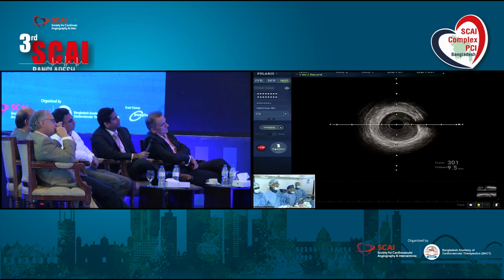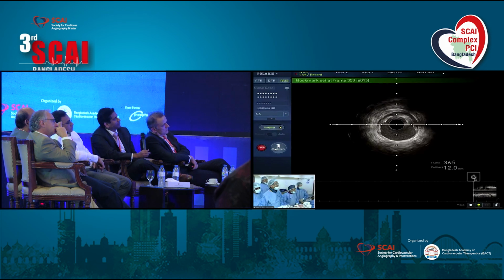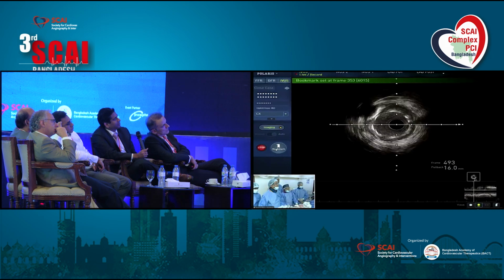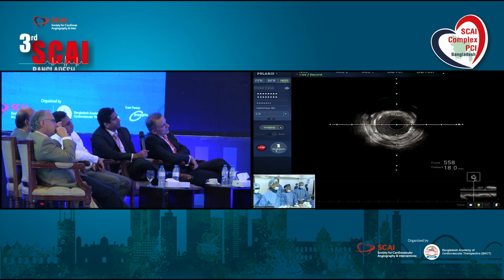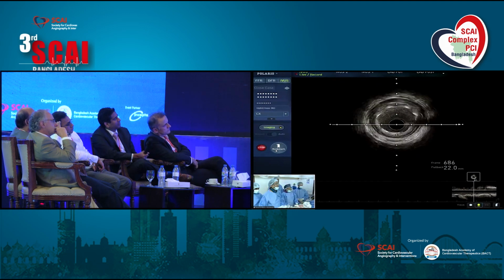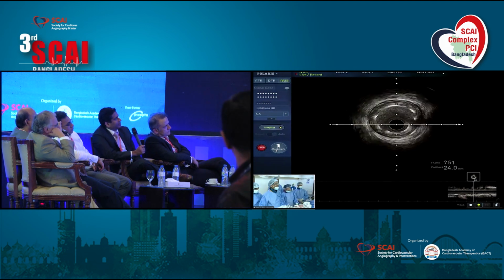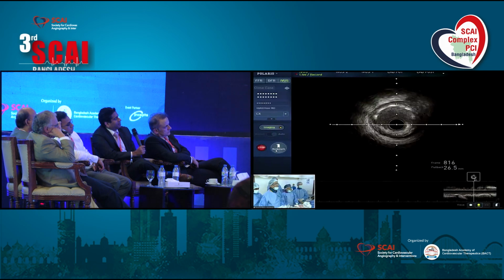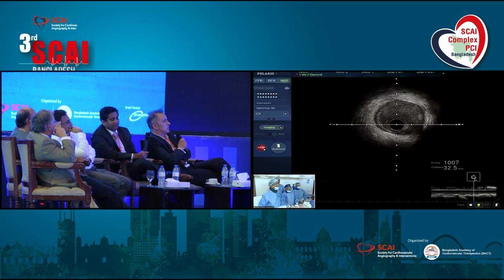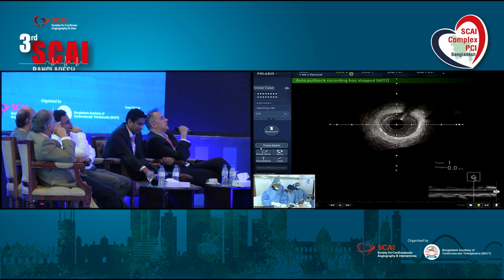Not yet, a stent has come. Distal to the, yeah, this is a stent segment. Here, yes, right there. So I think a bit further treatment is needed. Yes, we shall post-dilate further. We have not yet post-dilated. We just used the stent balloon.